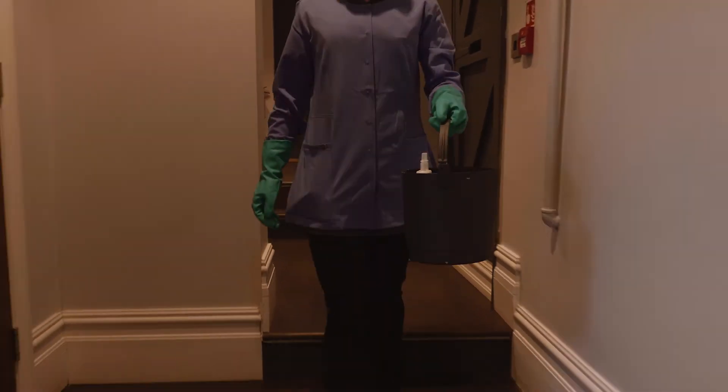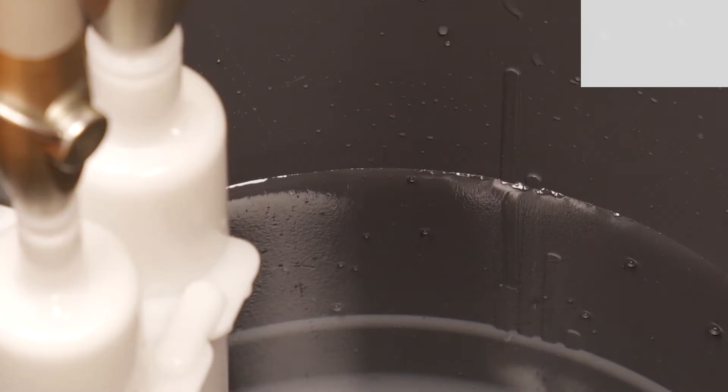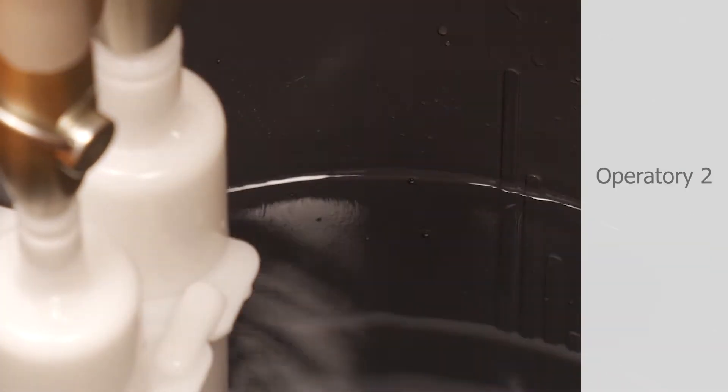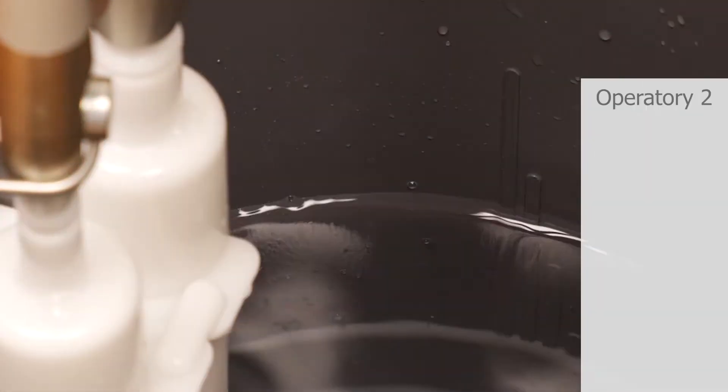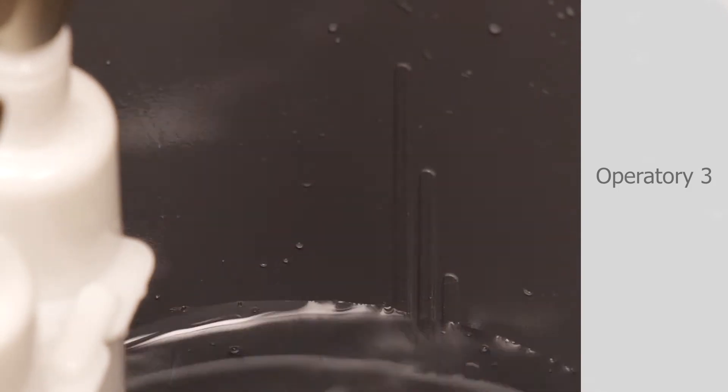Move the dispenser to the next furthest operatory from the central vacuum pump. Repeat this process and move on to the next operatory until all evacuation lines have been treated. Only leave suction on in the first operatory treated.